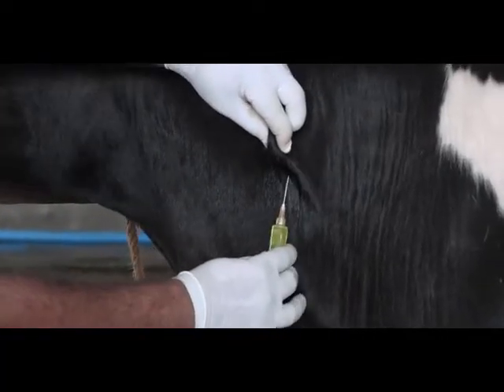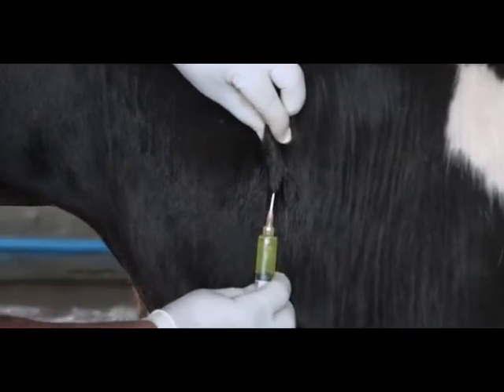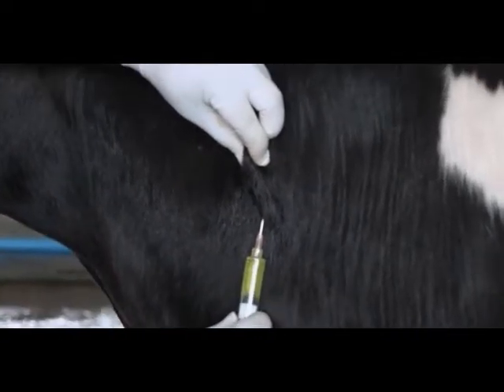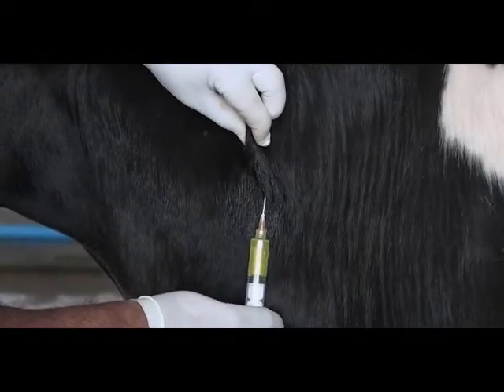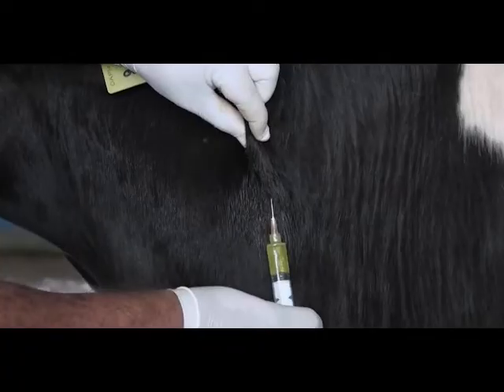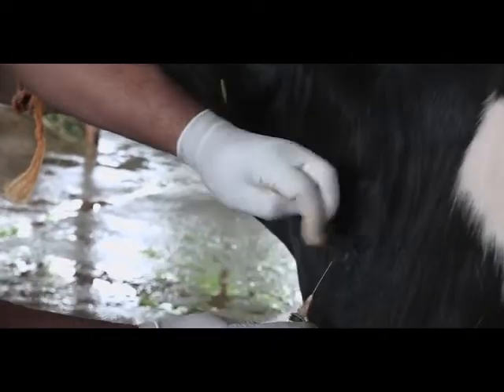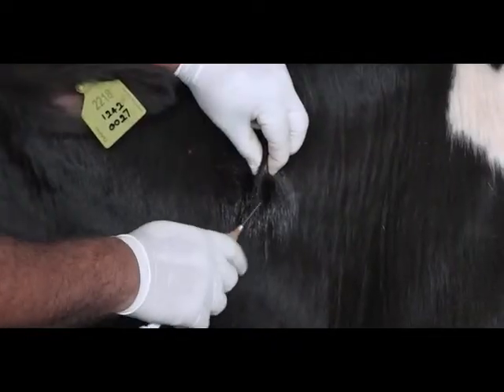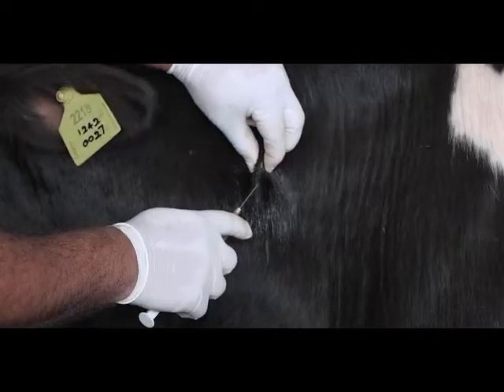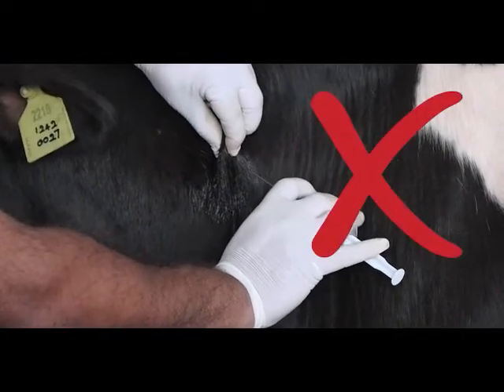Then pierce the skin along the skin fold as shown. Inject the drug into the subcutaneous space. Make sure not to pierce the skin perpendicular to the skin fold.